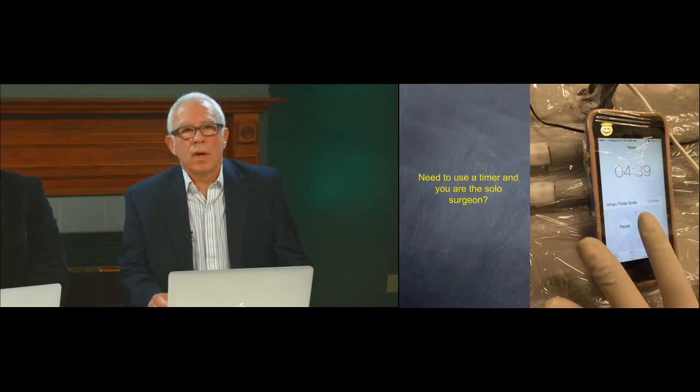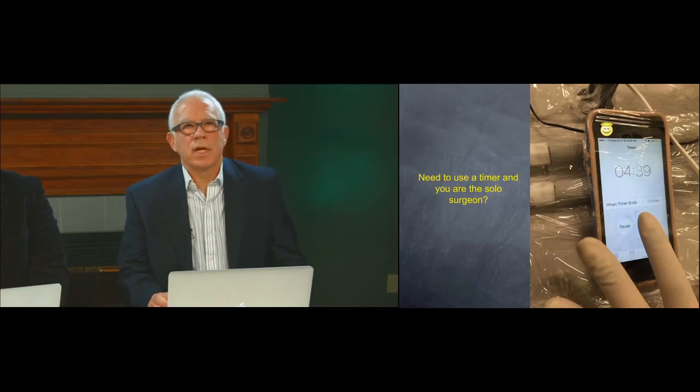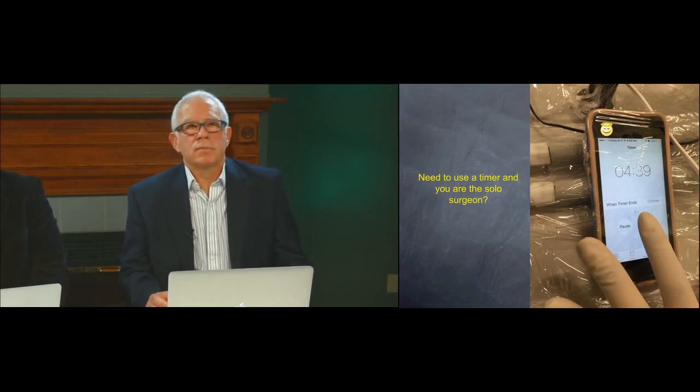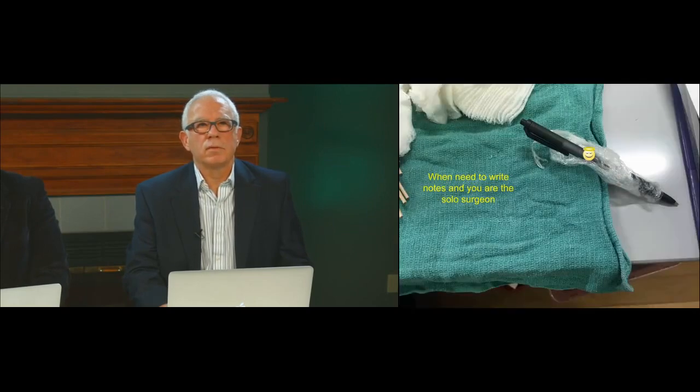I saw this and I was very impressed because this particular surgeon had to do timed injections, and as such she needed a timer. Now, if you touch the timer, guess what? You're going to contaminate your gloves. But she was very creative. Look what she did. She just covered her iPhone. Very easy solution. The same individual used cling wrap to wrap the pen because she had to write notes and results of her findings during surgery.